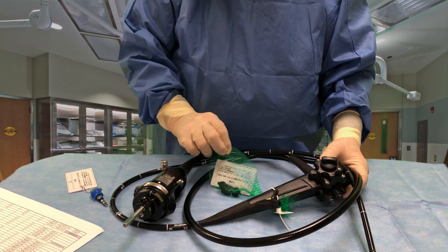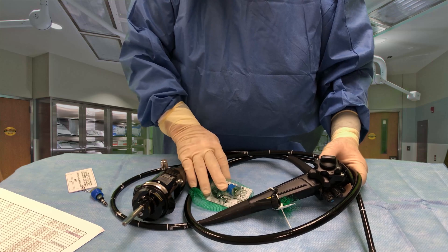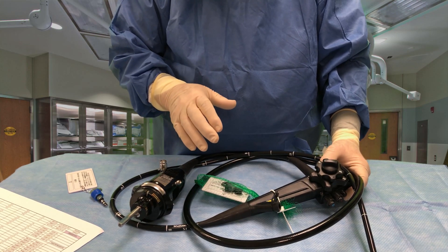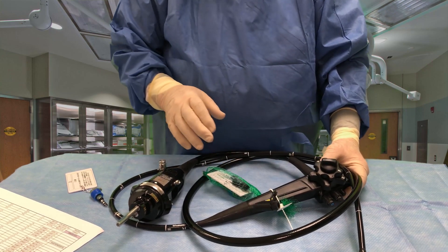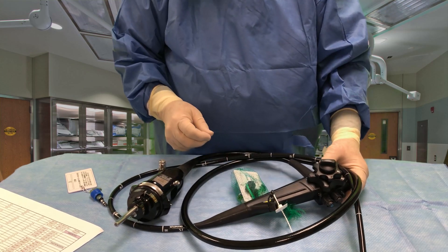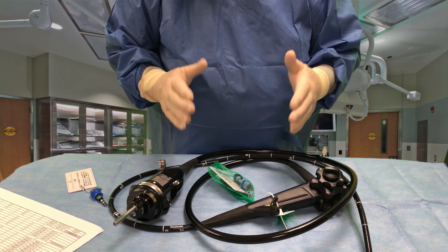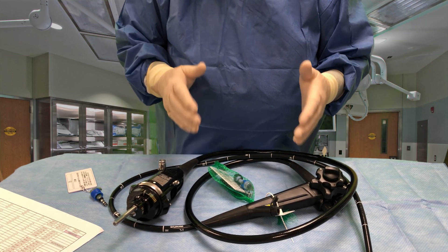This bag here — we call them avocado bags, but they're little green net bags — is where we put our valves. The valves are designated for this scope only. Each scope that we have has its own set of valves that go with it. That only changes if one wears out or needs to be replaced for some reason.